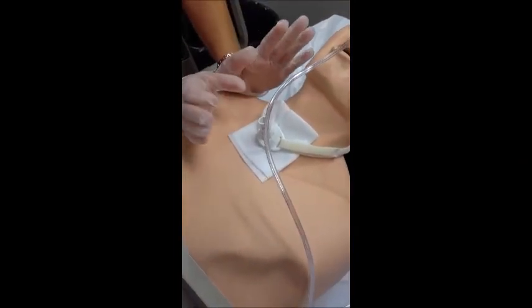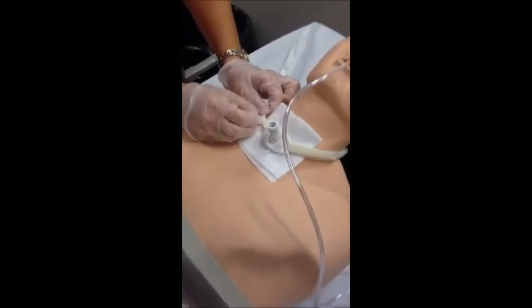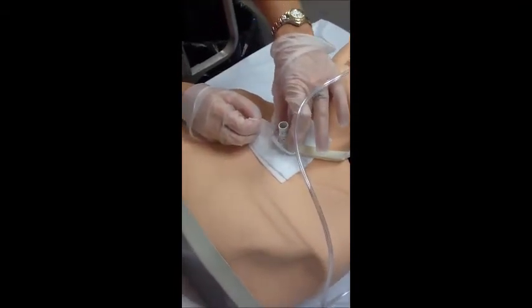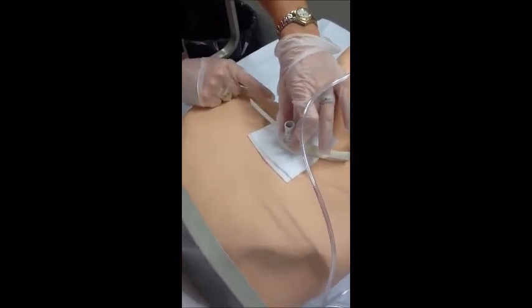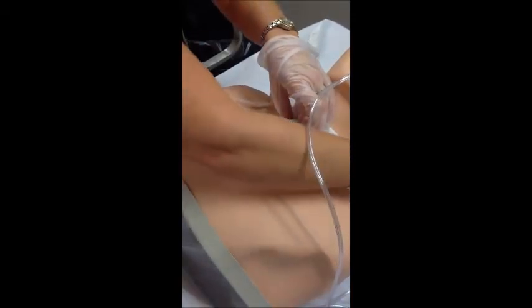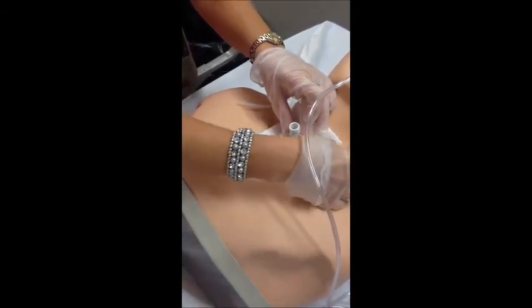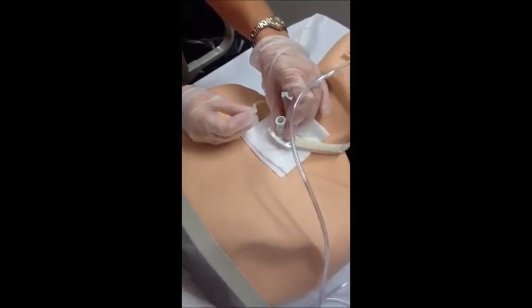The thing about taking your ties off, do one side at a time and hold your faceplate while you're doing it. Put your other side tie on and come around their neck and secure your new tie. Lots of hospitals have these handy dandy Velcro ones now, which are great.